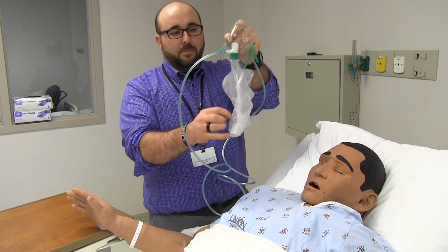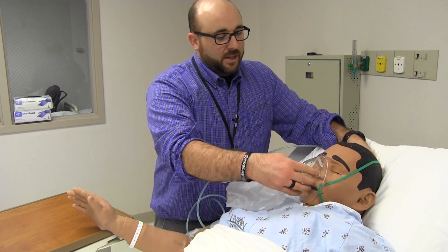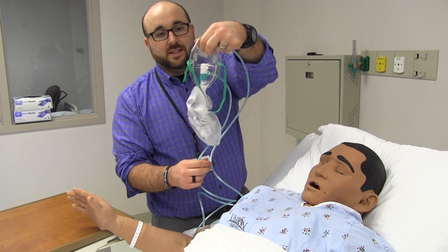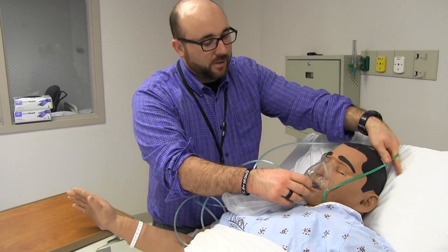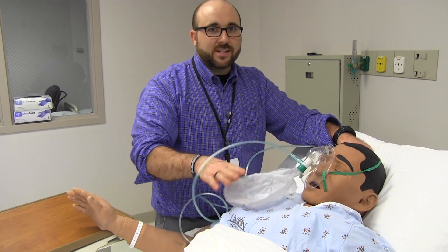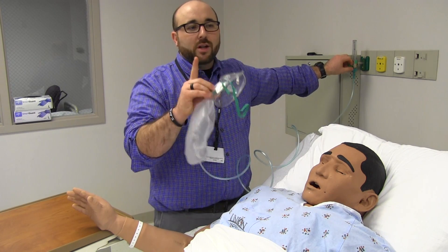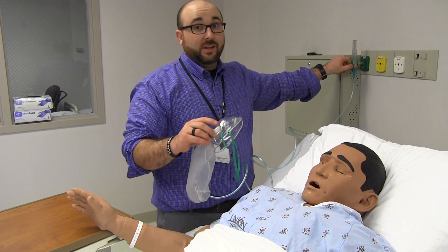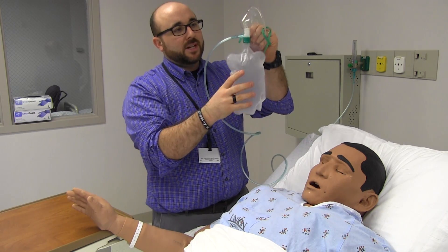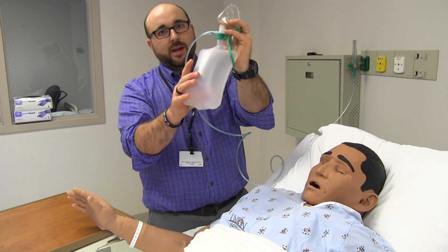With the non-rebreather, it comes like this with the little bag hanging off of it deflated — that means it's not ready to go. Don't put this on a patient with the bag deflated, because when they take a breath there's a one-way valve in here and they're pulling from nothing in the bag. On a non-rebreather, there's only one liter flow that goes on this: 15 liters or even higher. See what happened to the bag? It blew up. In that bag is 100% oxygen. You'll also see somebody put their hand over that valve to inflate it even faster when you need it.